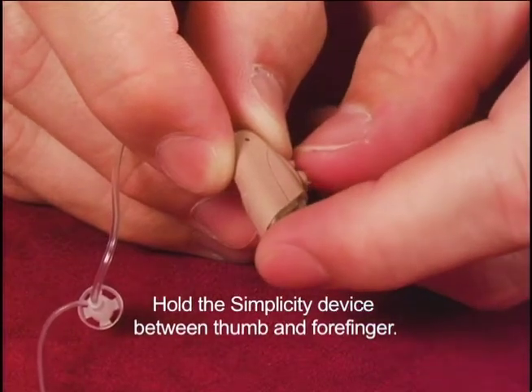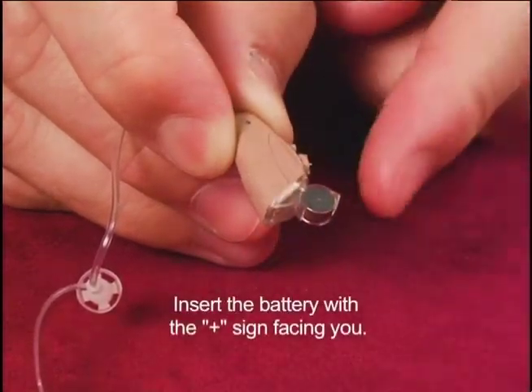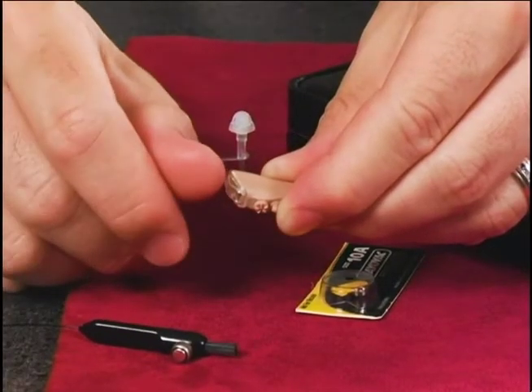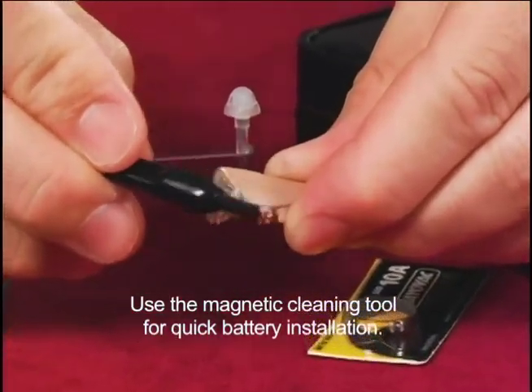Hold the Simplicity device on its side between the thumb and fingers. Carefully swing open the battery door. Insert the battery so that the plus sign stamped on the battery is facing you. Due to the small size of the battery, you may find it easier to install the battery by using the magnetic tip on the brush.